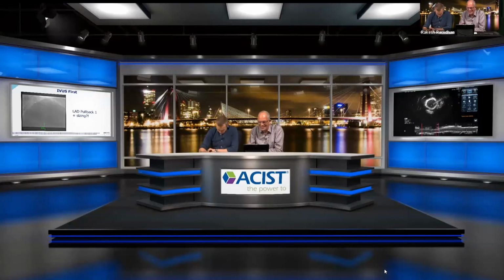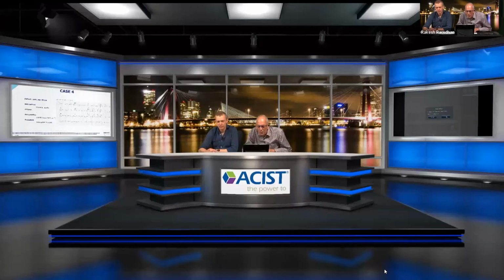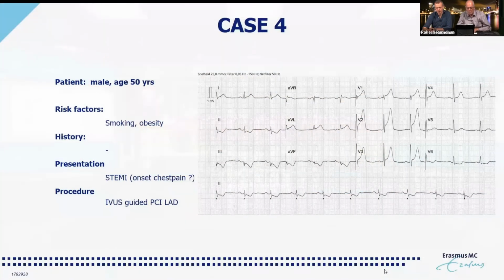One final case we want to show you. This is case number 4. This is interesting. It's a younger patient, a 50-year-old male, 6'2", smoking and obesity. Maybe we can show the slides. A 50-year-old male, smoking, obesity, also presented with a STEMI with ST segment elevation anterior.